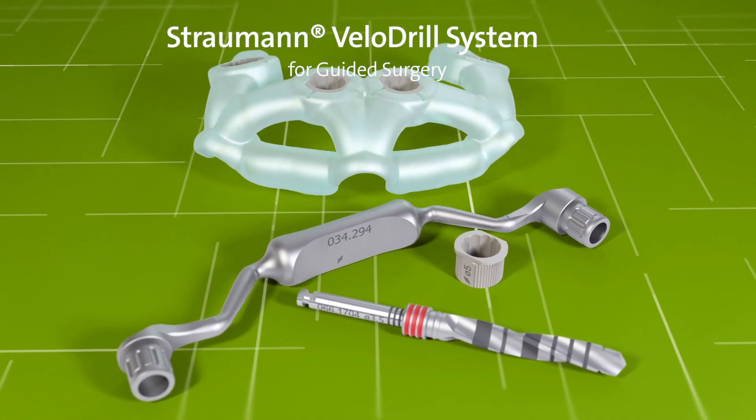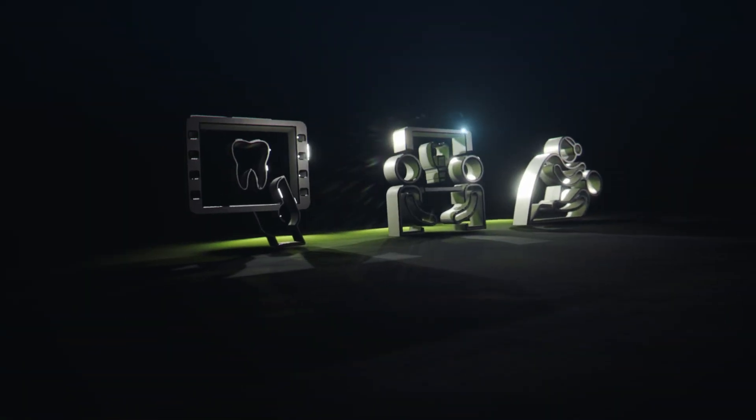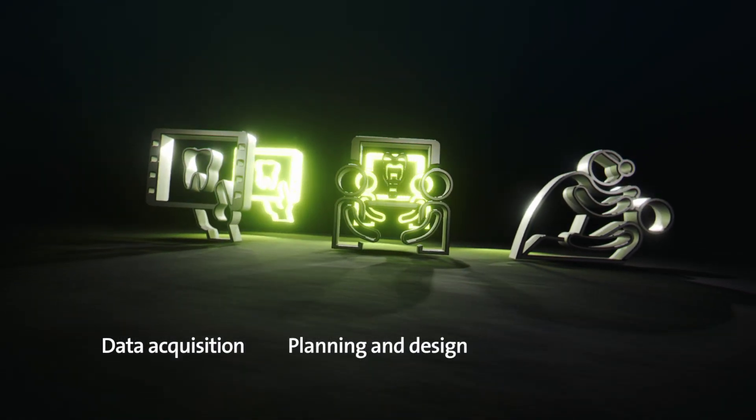This video demonstrates the Straumann Velodrill system for guided surgery. The Straumann guided surgery workflow is divided into three steps: data acquisition, planning, and surgery.